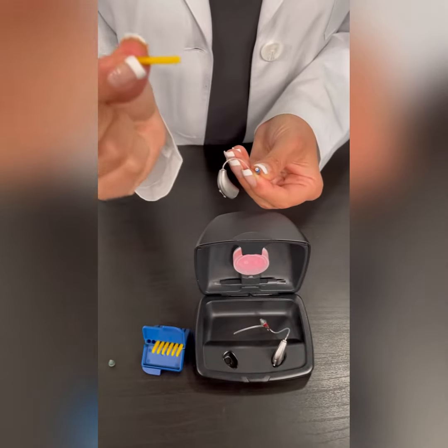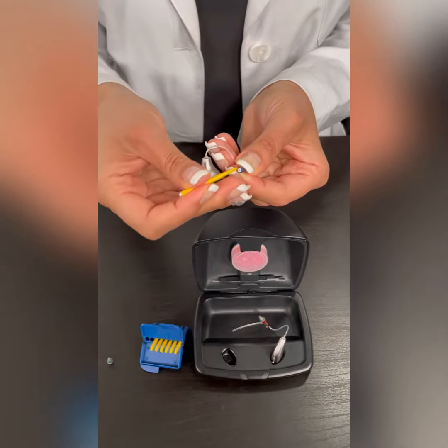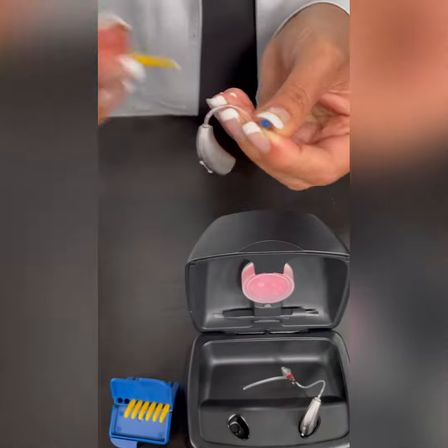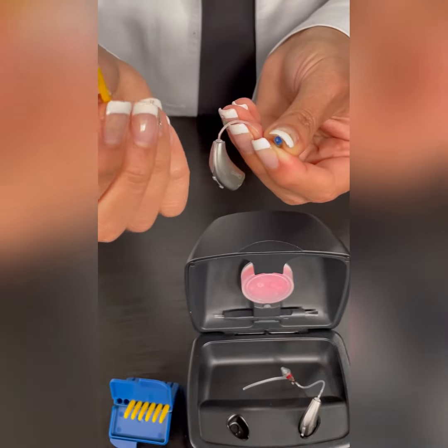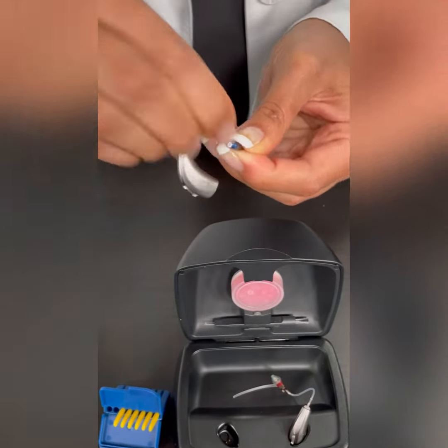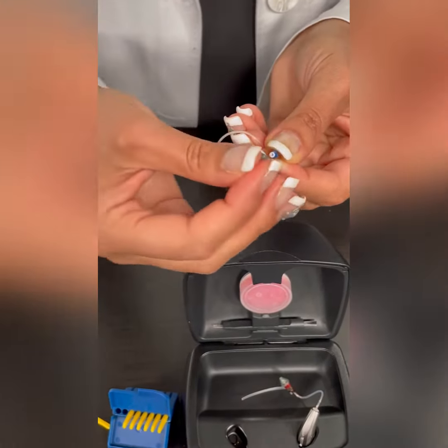You will want to use the empty end of the stick to remove the current filter. The stick inserts as such. You will pull it out, flip your stick over, and insert the fresh filter. You will then put your dome back on.